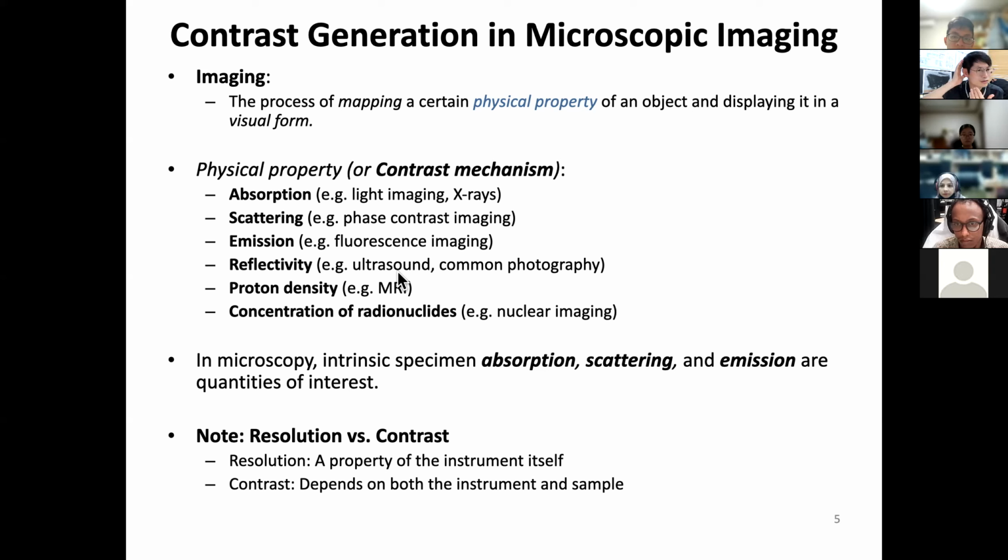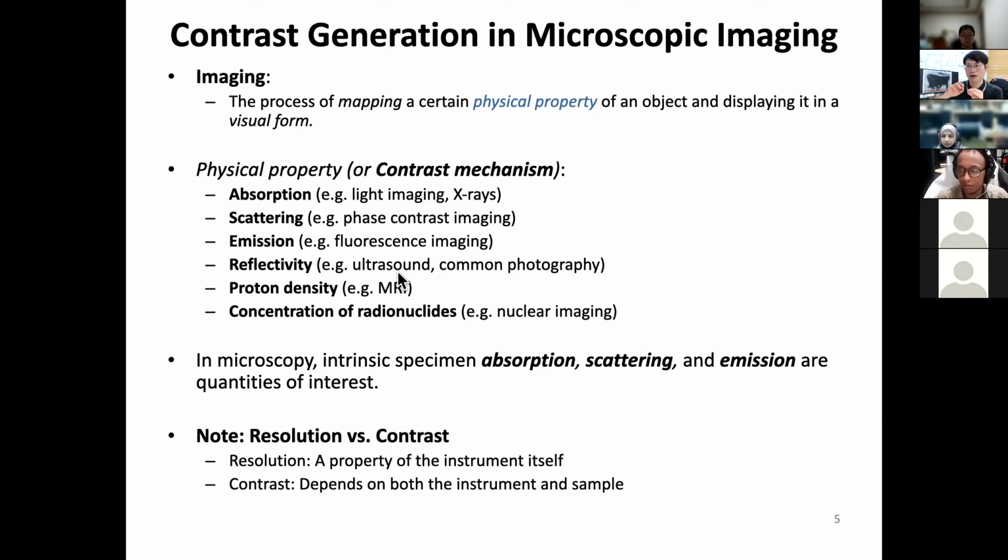So we just listen to the sound, especially the time of flight, and then we can find out the distance of the reflection and the strength of the reflection, and that gives us a nice ultrasonic image. So where does the contrast come from? The contrast comes from this wave reflection at the interface, or wave scattering with some part inside your body.